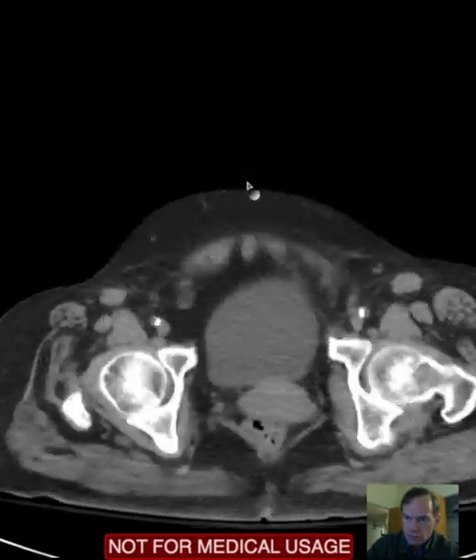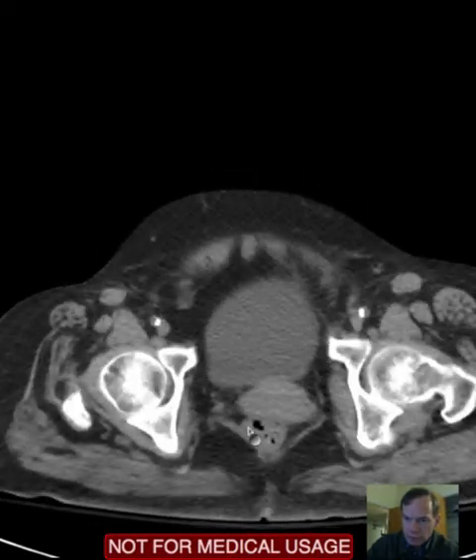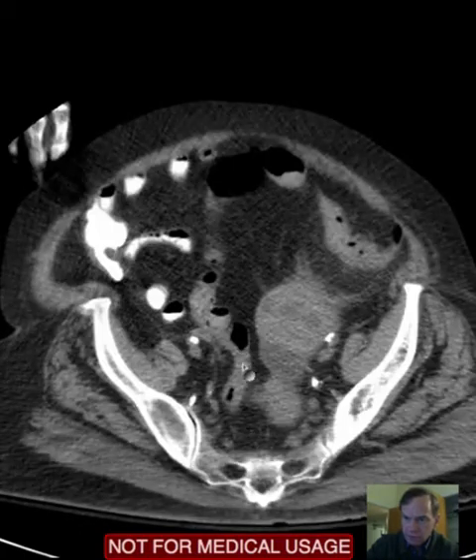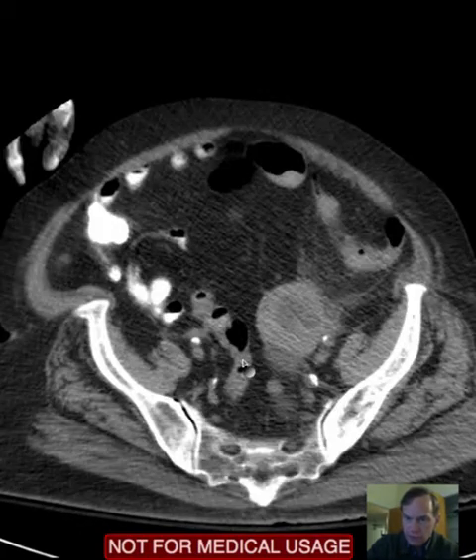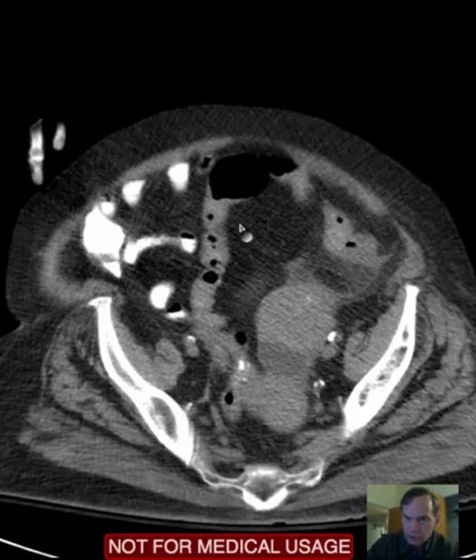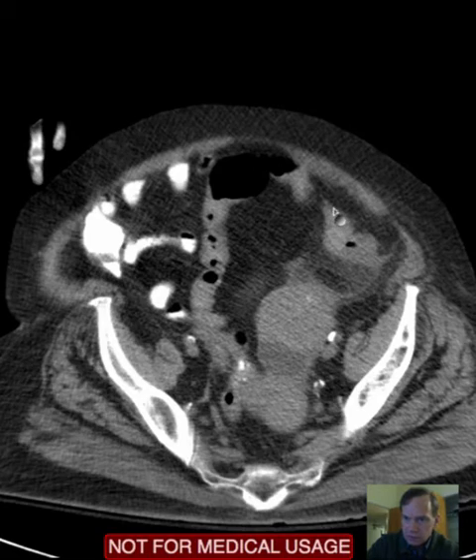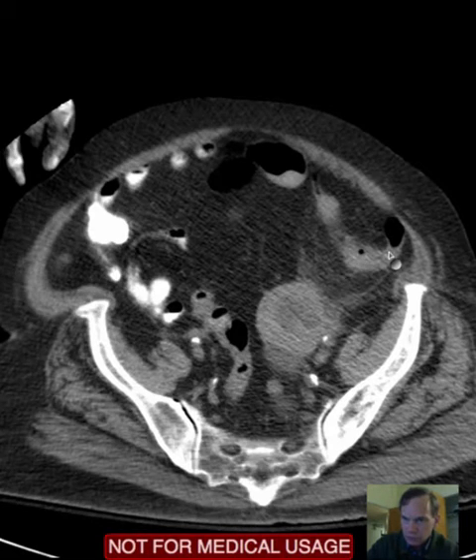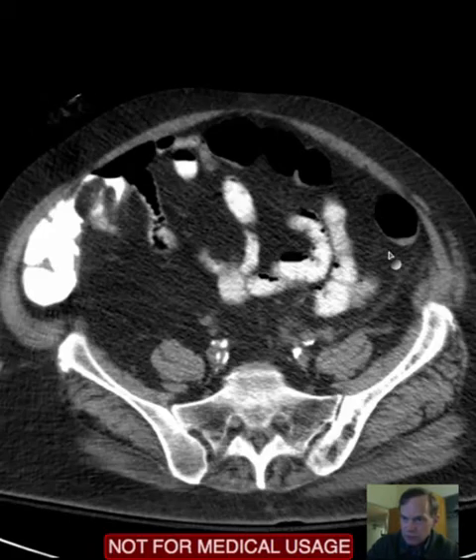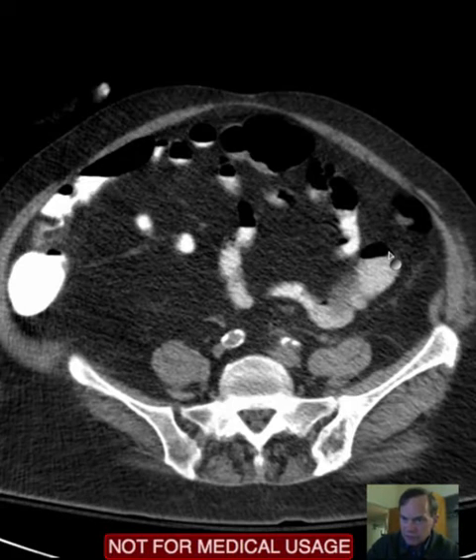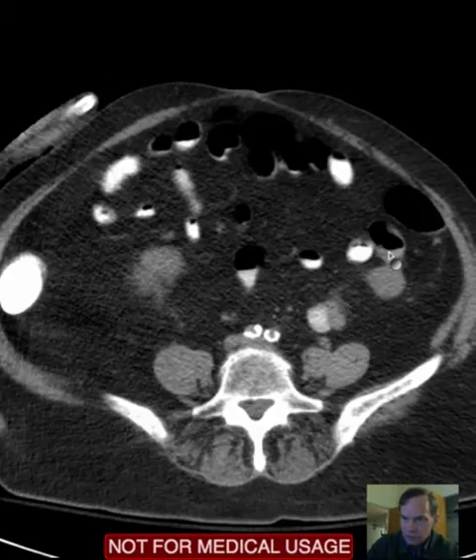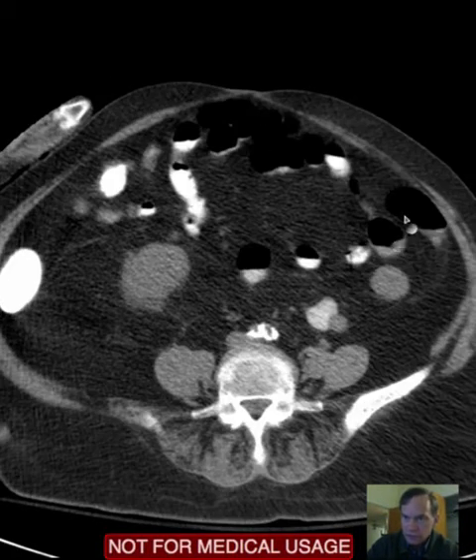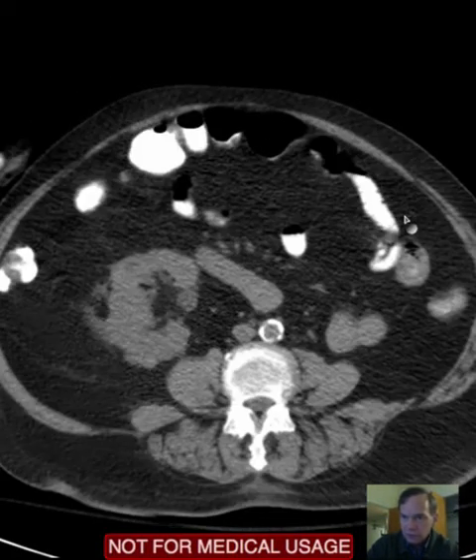Here we have rectum, and we can follow bowel reasonably well. Here we have the sigmoid colon, rather tortuous. Here we have the proximal sigmoid colon affected by that epiploic appendageitis. We can follow the colon back.